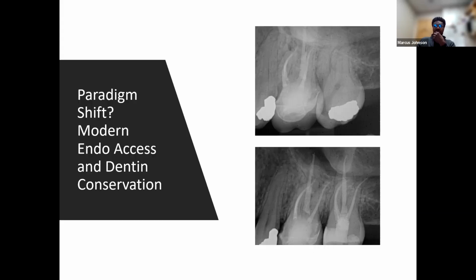Debridement, we don't need to go on that too much because I'm not going to talk about cleaning and shaping, just more or less highlighting some of the cases. So this was another case, as you can see, a significant dilaceration.